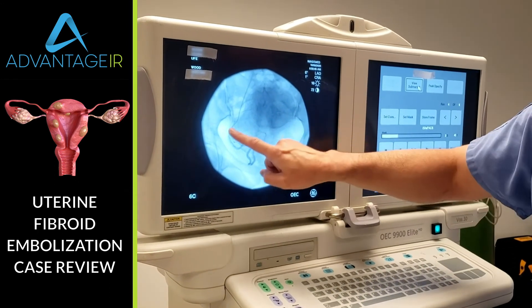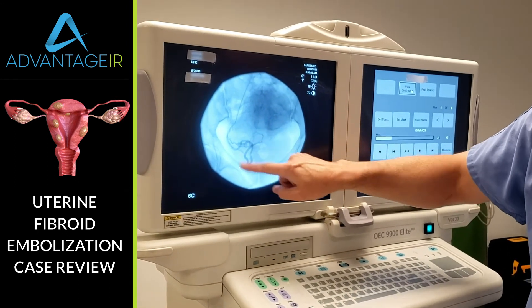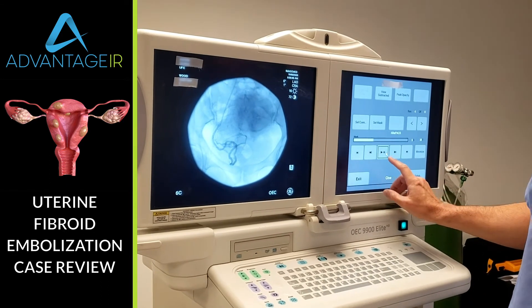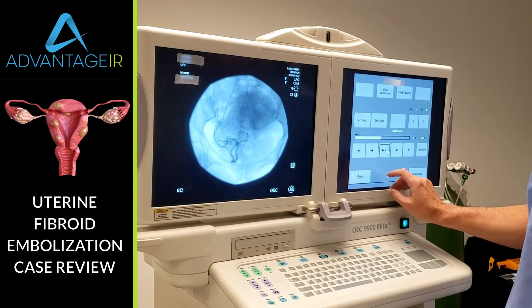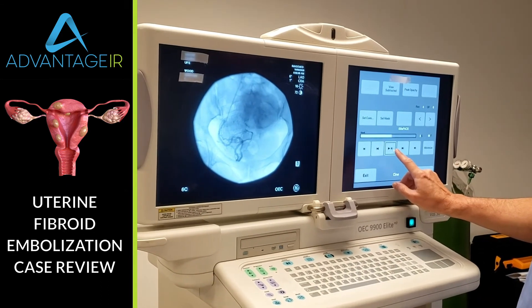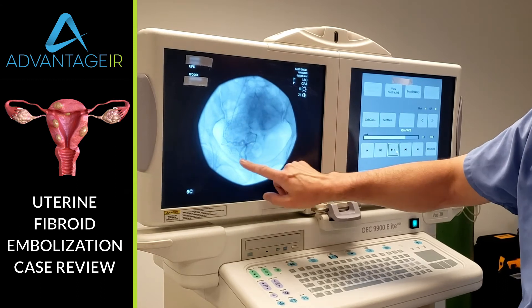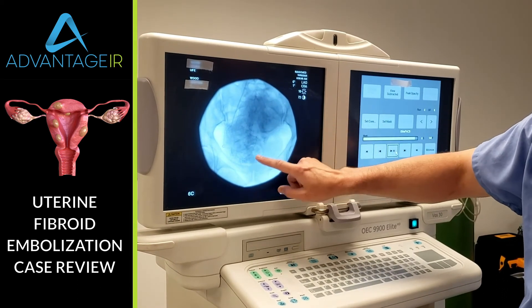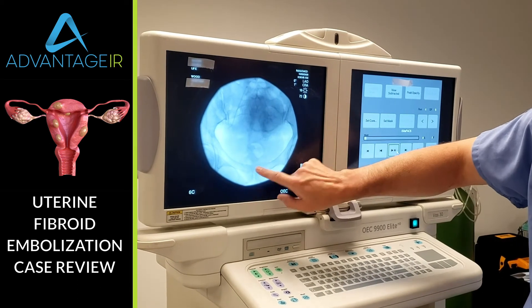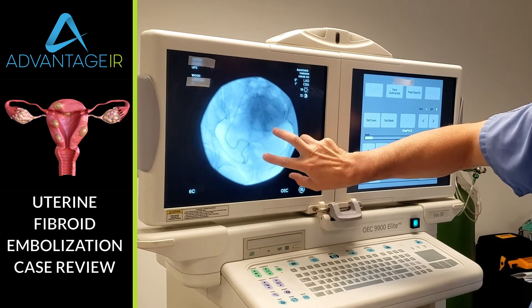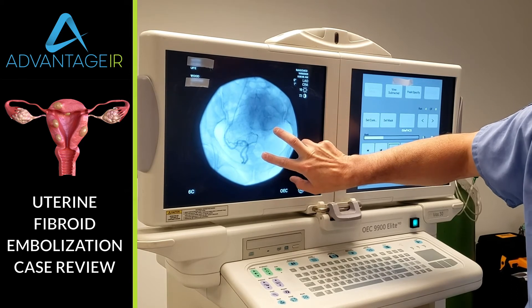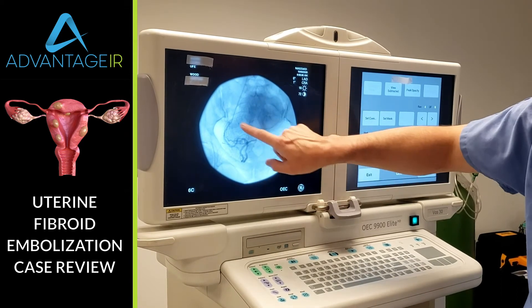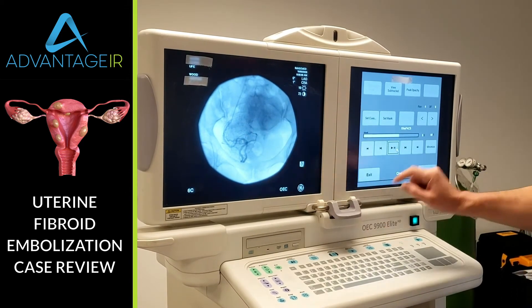Now we're going to treat the second large fibroid right there. We can let that angiogram play out and see the contrast dye perfusing into that fibroid there — see that dark staining? So we've got kind of twin fibroids here, very similar size, and now we're going to treat the second one.